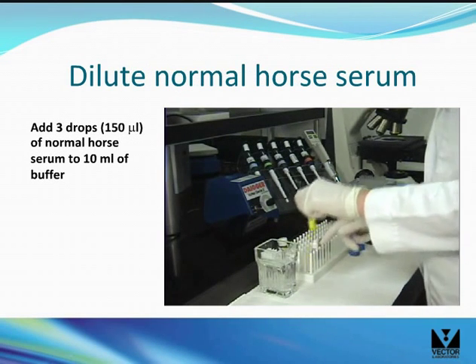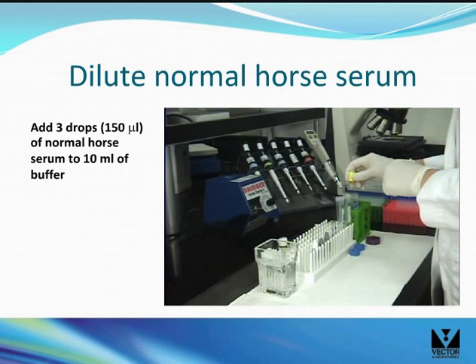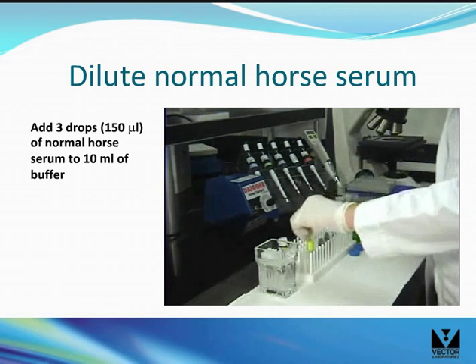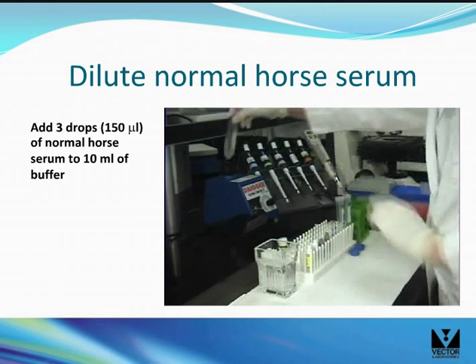According to the instructions, make up the working solutions for the ABC kit by diluting the stock reagents. This may be done in empty dropper bottles provided or in polypropylene tubes as shown. Add three drops of normal horse serum into 10 mLs of buffer and mix well.